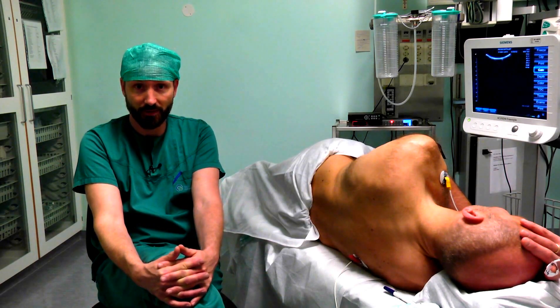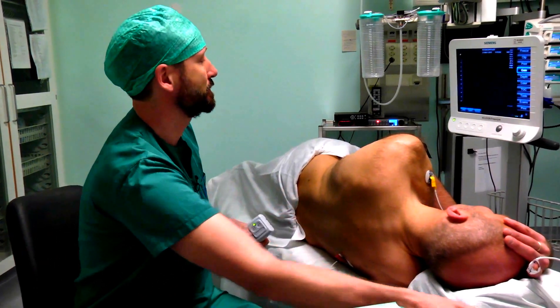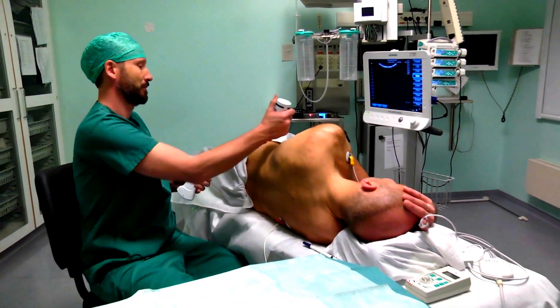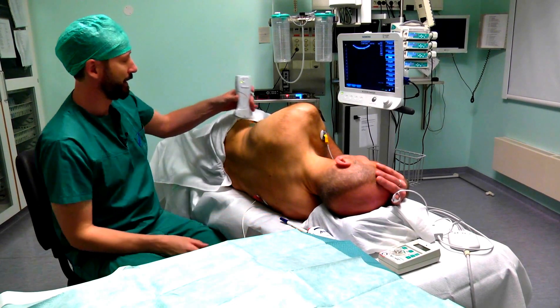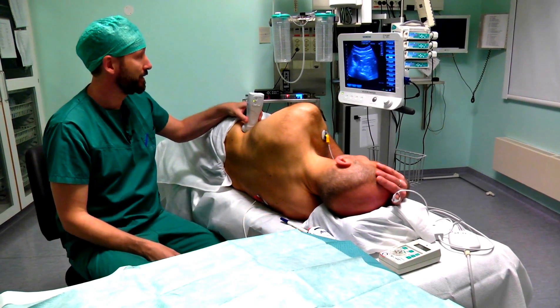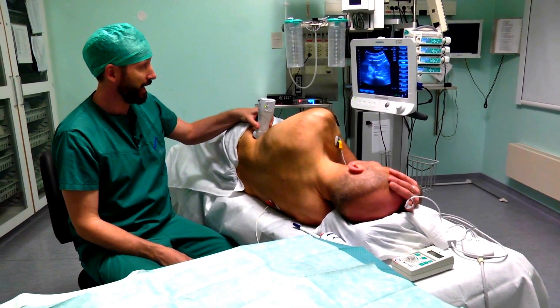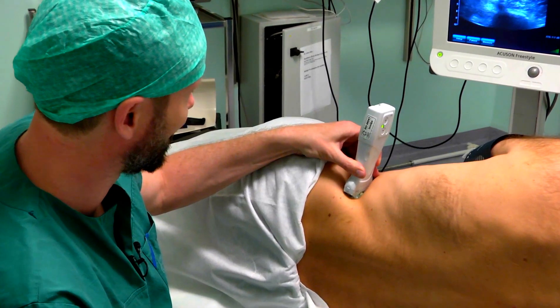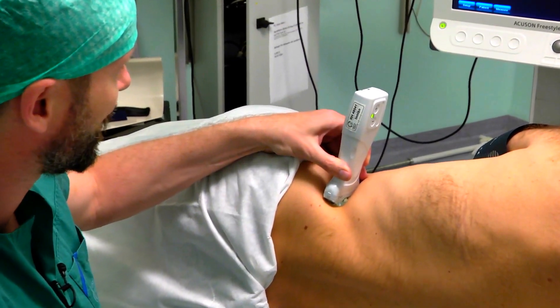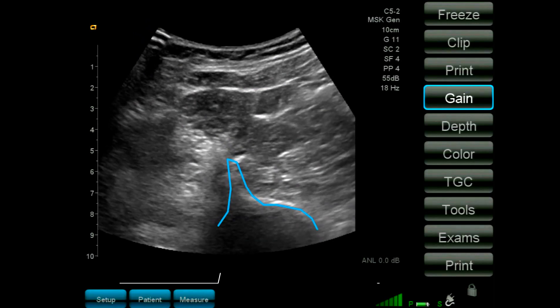I start with a scan of the anatomy. I try to direct the probe in the direction of the L4 vertebra. And what we can see is the body and the transverse process of the L4 vertebra.